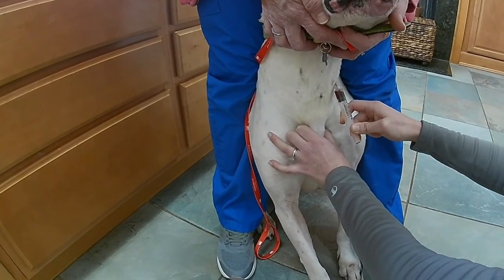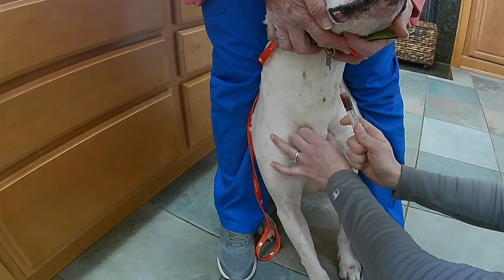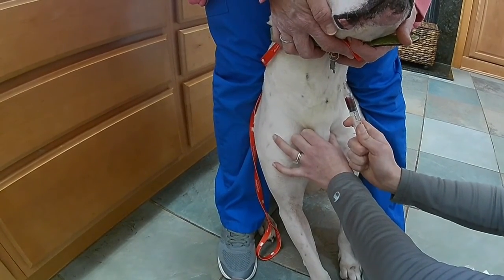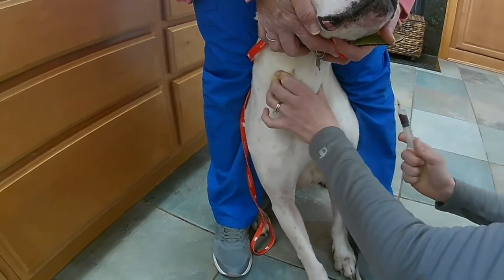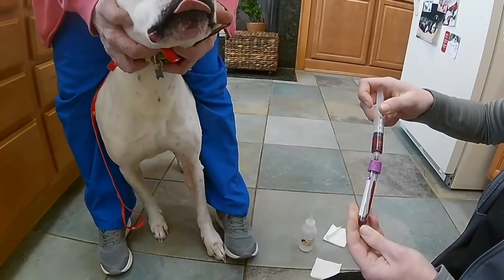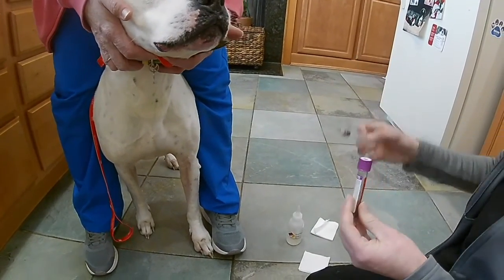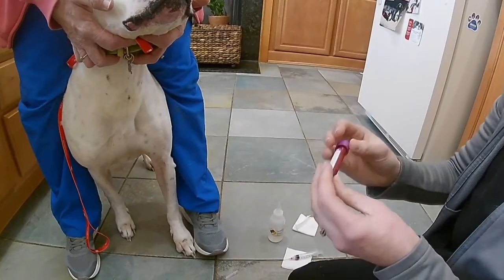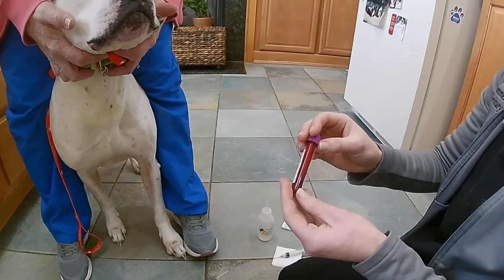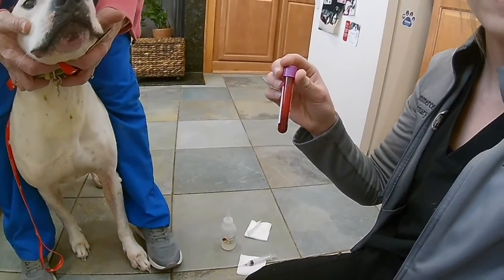All right, we're flowing. Good job, Vader. Well, I lost it. So I'll take what I got. I got about 2 mLs here. I'm going to add that into my tube, which actually is about the perfect amount here. And I'm going to rock it back and forth gently, inverting it to mix that anticoagulant into the blood. All right, and there's my blood draw.